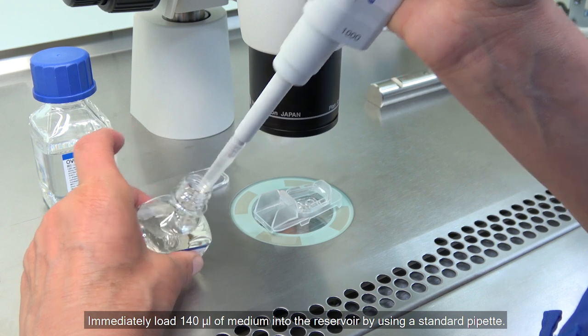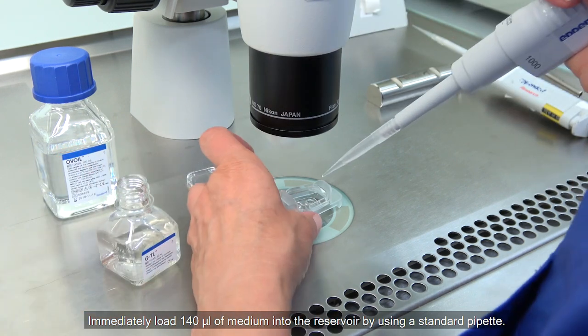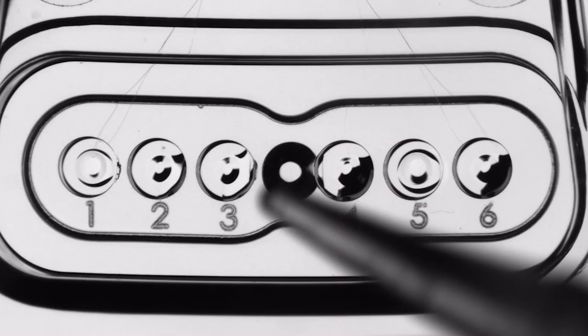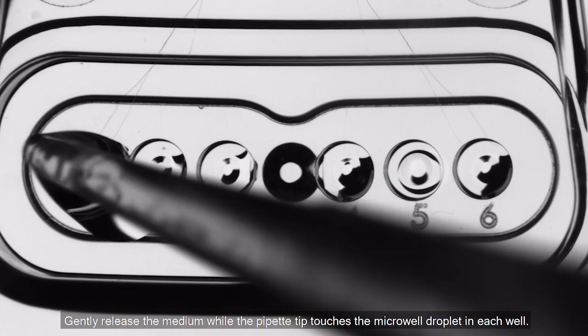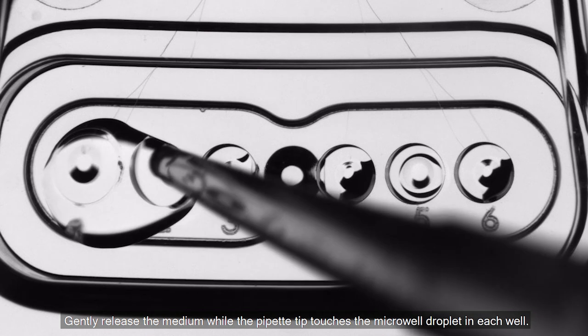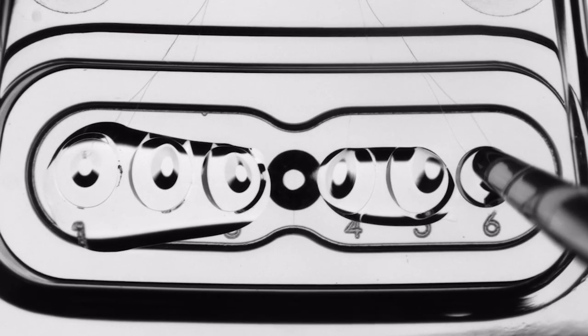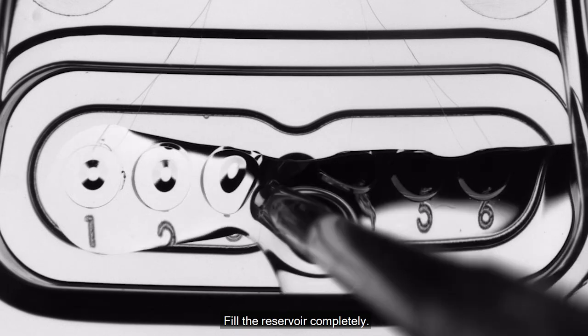Immediately load 140 microlitres of medium into the reservoir using a standard pipette. Gently release the medium while the pipette tip touches the micro well droplet in each well. Fill the reservoir completely.